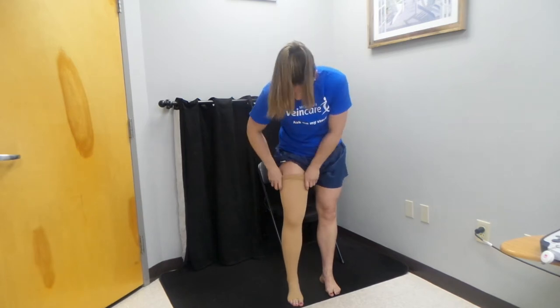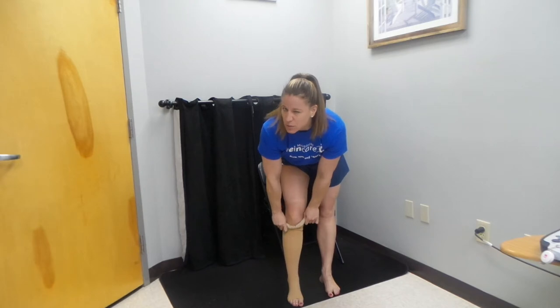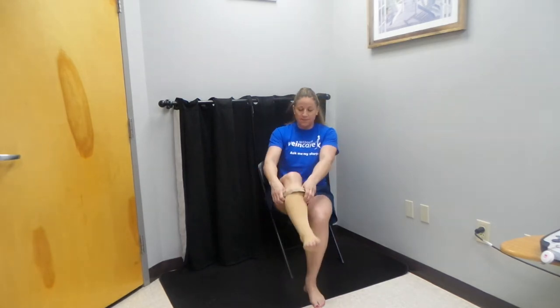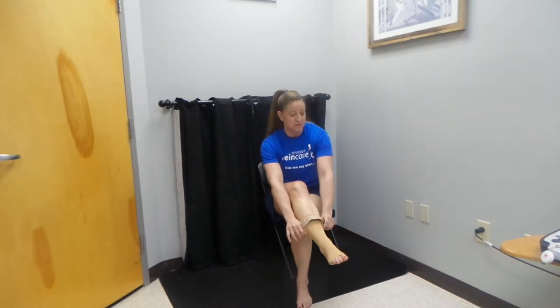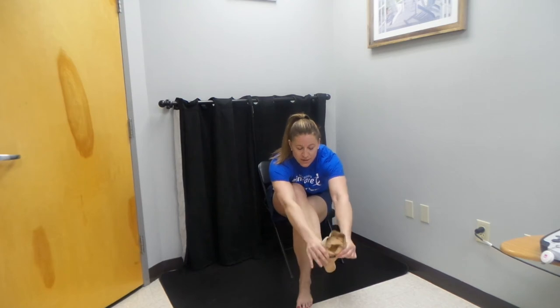So we'll start from the top and we'll work the stocking down. It's now beneath my knee, so we're good. I can have a seat, cross my leg — don't have to — whatever is easiest for you and whatever is most comfortable. Go ahead and work that stocking down, pull it over the heel, pull it off of the foot, and there you have it.